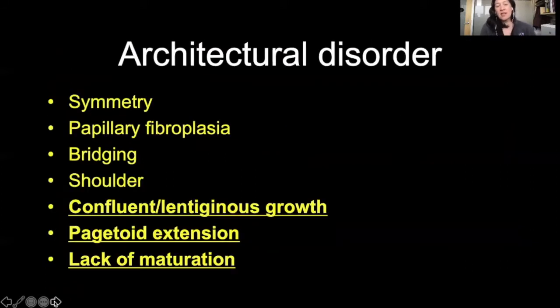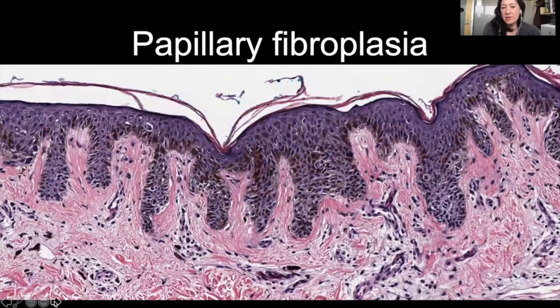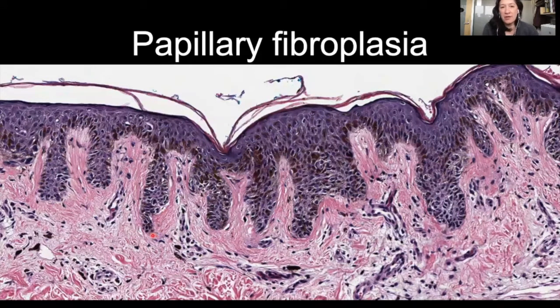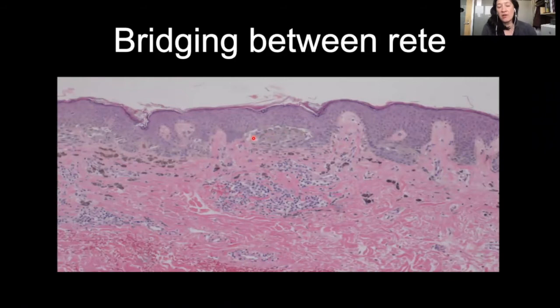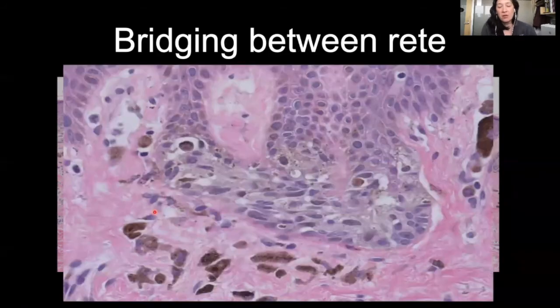Symmetry — two halves not being the same. Papillary fibroplasia is thickening of the collagen in the superficial papillary dermis, right under those rete ridges. You can see it visible on H&E — you don't need special stains, just that thick, wiry collagen. Bridging between rete ridges is where you get joining together of adjacent rete ridges with atypical melanocytic nests. You can have even horizontal nesting. Here's a closer look at that.